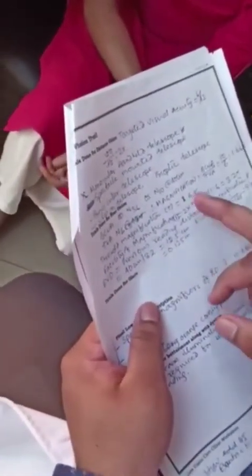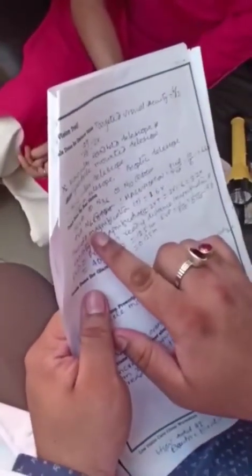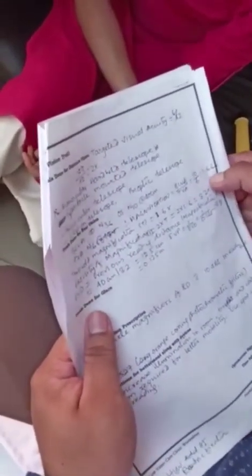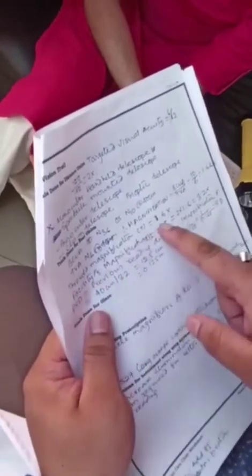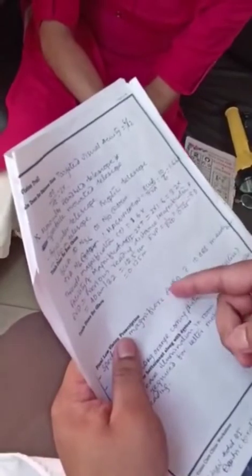Now coming to the near vision, how is it? BCVA for her is N36 and N10 at 40 centimeter. So our targeted visual acuity, as she is a student, we should give N6. Clear? So magnification should be BCVA by TVA. So 10/6 is 1.66, and threshold magnification is basically 1.6x. Now to facilitate that, we need 2 multiplied by whatever threshold magnification you got, that is 2 into 1.6, that is 3.2x. If you give this magnification, the patient can read with ease, without any difficulty.